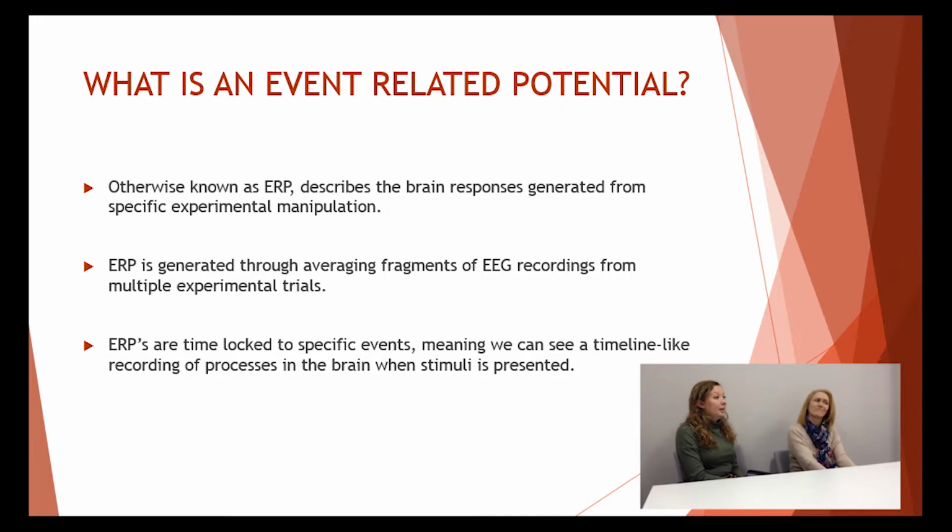EEG could be seen as the least invasive method of assessing brain activity, so we don't have to worry about any negative impacts on the participant. So what are some other advantages of using ERP?